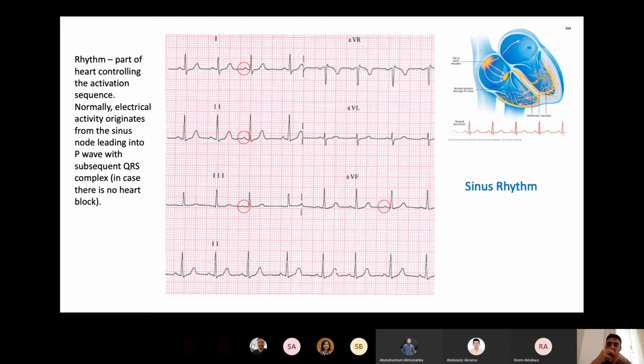Okay, so this is where the sinus node is located, and the electrical activation starts from the sinus node, of course, and travels elsewhere, right? So the electrical activation goes from top to bottom, from right to left. Agree? So it goes from top to bottom.